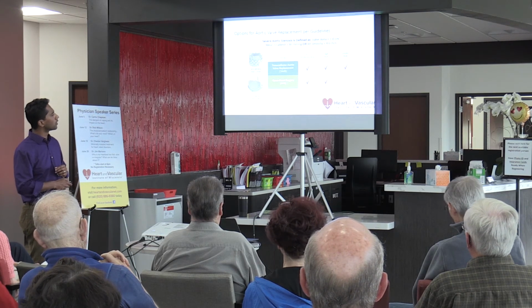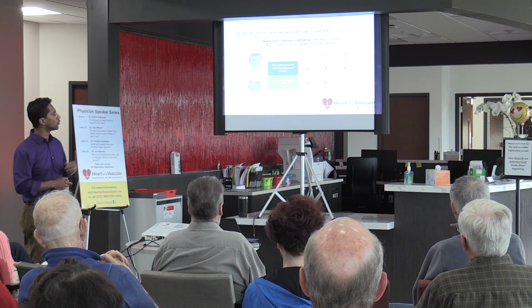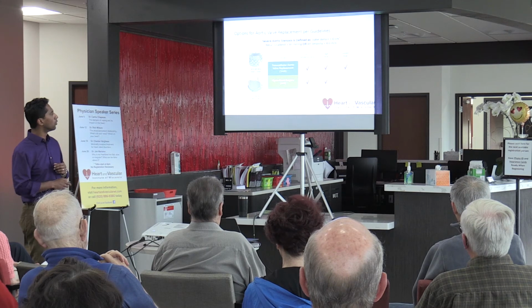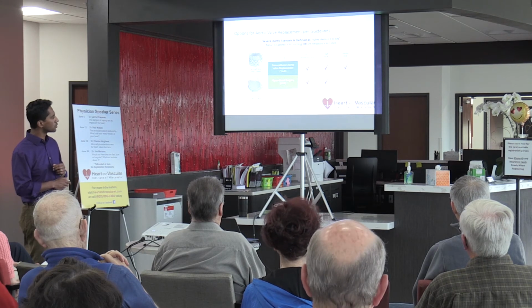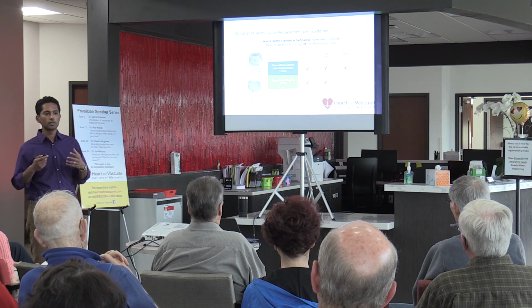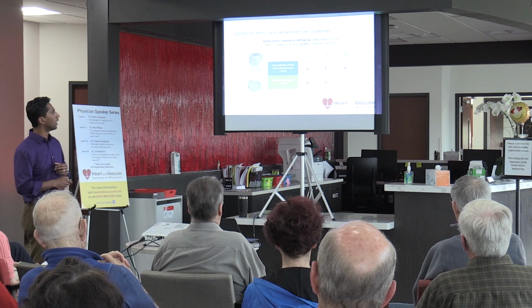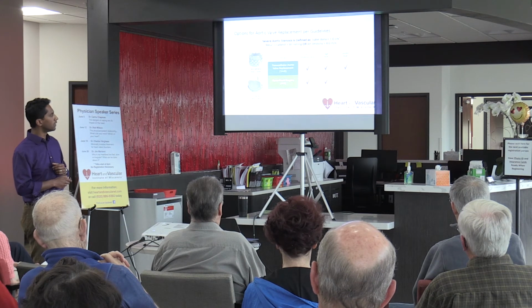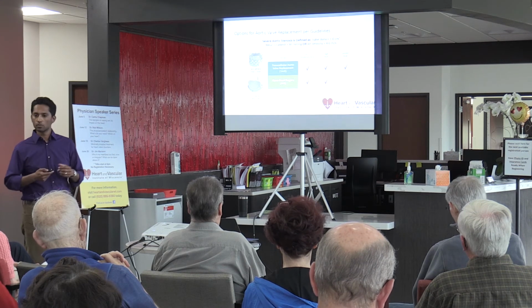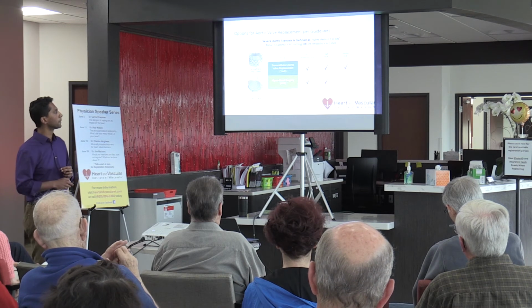So as far as options, right, for treating aortic stenosis, unfortunately this is one where we have both an invasive option, which is the tried and true open heart surgery, right, that everybody's heard of. That's where they open your breastbone and they surgically replace the aortic valve. And then the more minimally invasive option, which is TAVR, which is what we talked about at the beginning, which is transcatheter aortic valve replacement.